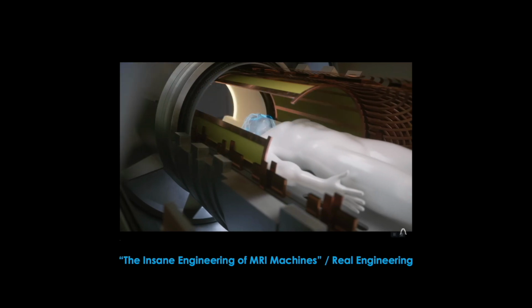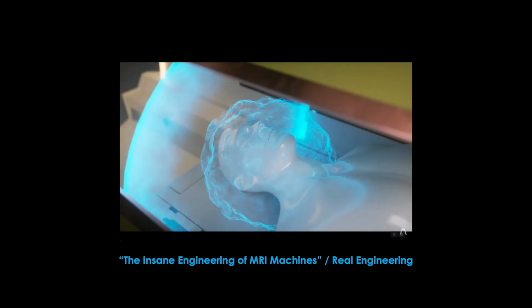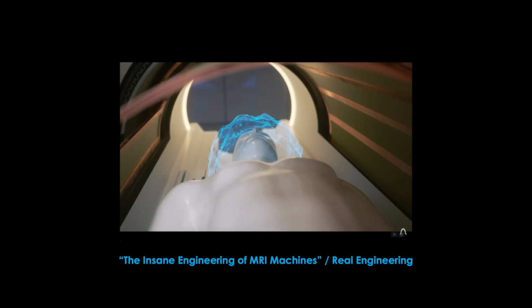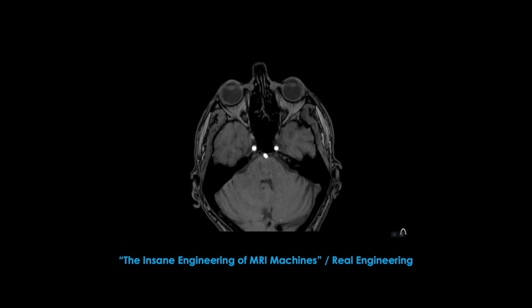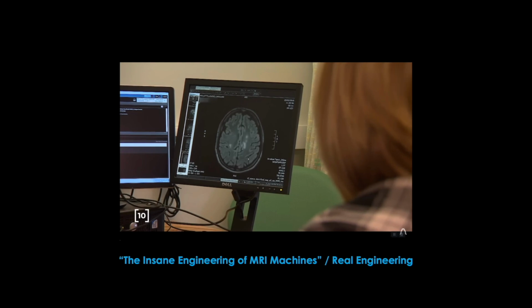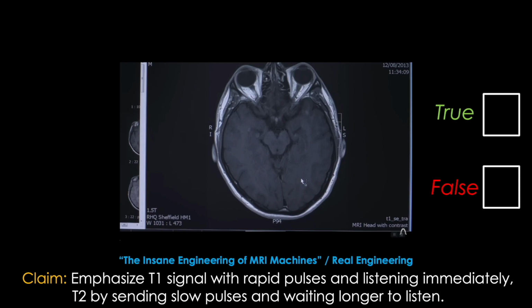Okay, next clip. We can emphasize the T1 signal by sending pulses rapidly and listening to the signal immediately, as the dephasing effects of T2 do not have enough time to take place. We can emphasize T2 by sending pulses slowly and listening for longer, allowing the dephasing to occur, the time between pulse repetition and how long to wait to listen for a signal. These two parameters are chosen by the technician each time an MRI is performed, and they choose them depending on what the doctor would like to image. Claim. Emphasize T1 signal with rapid pulses and listening immediately, T2 signal by sending slow pulses and waiting longer to listen.